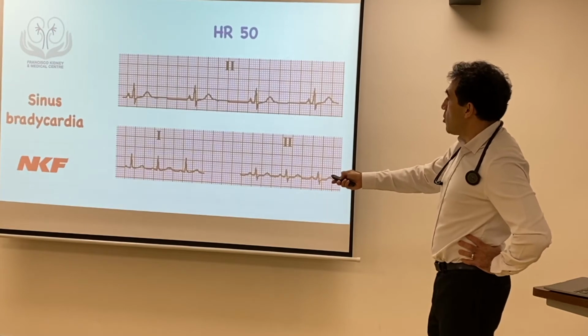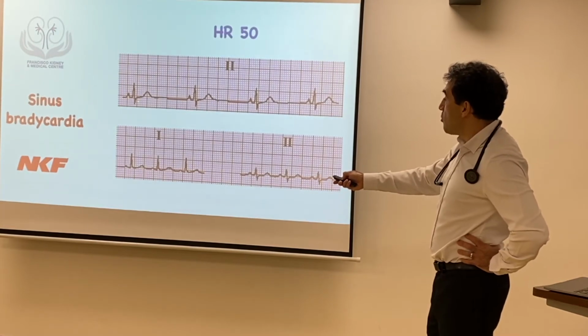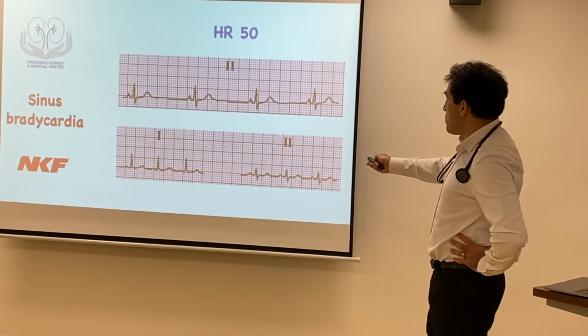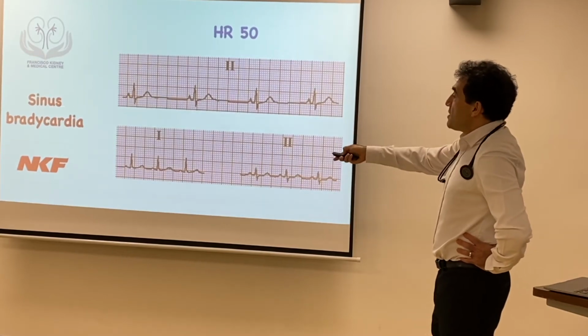It's a normal morphology P wave followed by a QRS complex. Every single P is followed by a QRS complex. Everything looks normal, so it's just simply a sinus bradycardia.